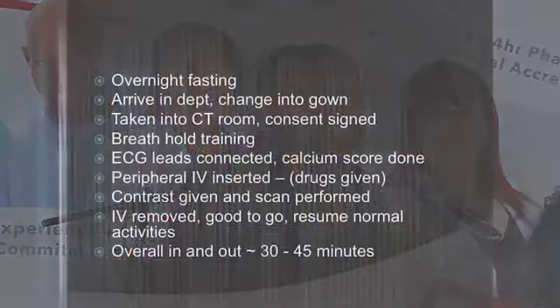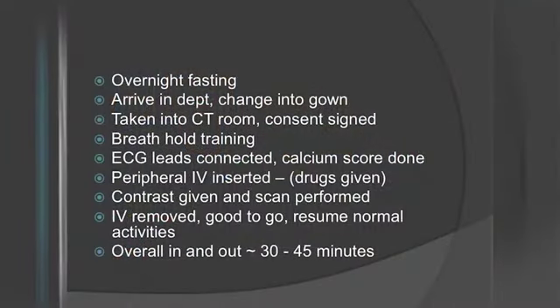Overnight fasting. When the appointment is given, you arrive in the department, you change into the gown, you're taken into the CT room, you sign a consent. Okay, I'll come to the risks. There's a short period of breath hold training where you'd be told how to hold your breath for the scan. And I'll come to how short that is. ECG leads are connected because obviously the heart is beating, so we want to take the scan with the heart beating, and you need to monitor the heart while the scan happens. So ECG leads are connected.